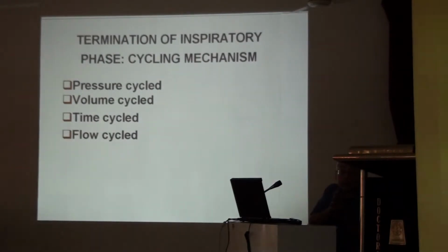Now comes termination. This is a very boring lecture. Why? Because the same terminology, four terms, keep coming and going cyclically. The termination of the inspiratory phase. Classically, when we were students of critical care or anesthesia house terms, my teachers taught us only this part: the pressure cycle, volume cycle, time cycle, flow cycle.